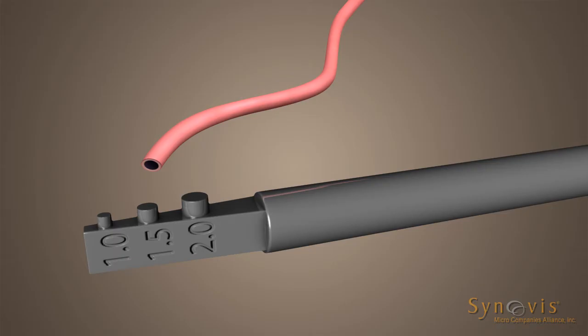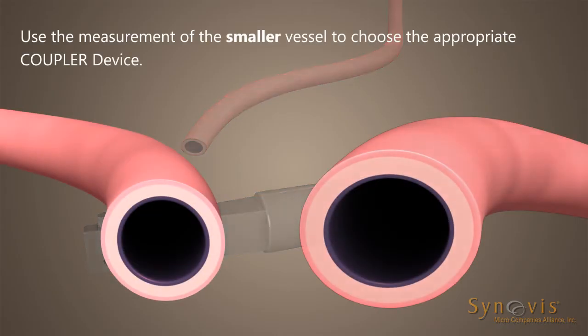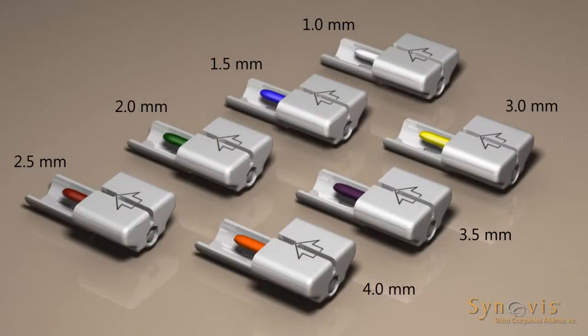After gentle dilation, estimate the outer diameter of each vessel using the vessel measuring gauge. If there is a discrepancy between the two vessels, use the measurement of the smaller vessel to choose the appropriate coupler device. Then select the appropriate sized coupler device.